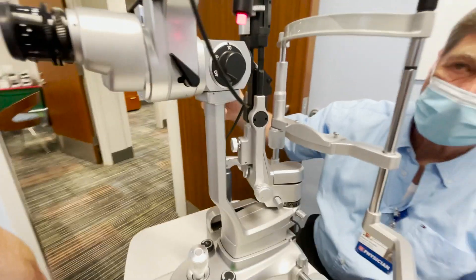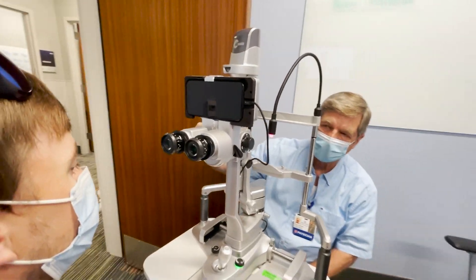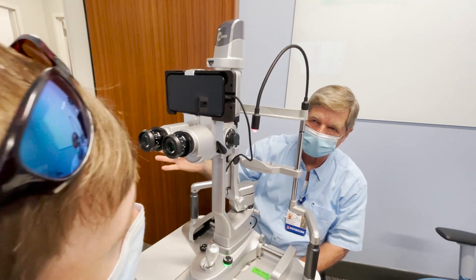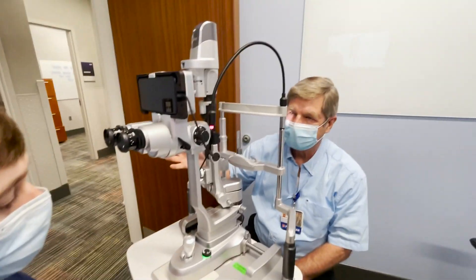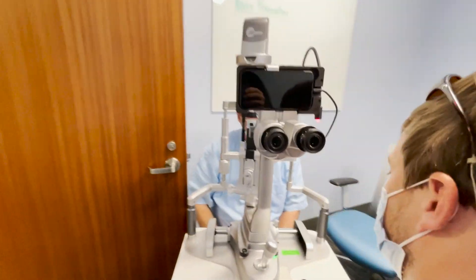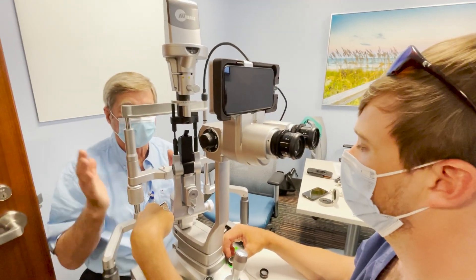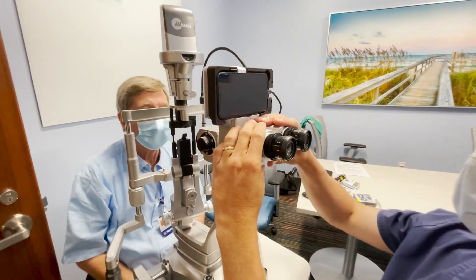You should decide whether to go over how to focus using your own diopter number on the lens — it's the same thing we did with microscopes in second year. You'll want to set it to the same thing every time, and the same applies to interpupillary distance.